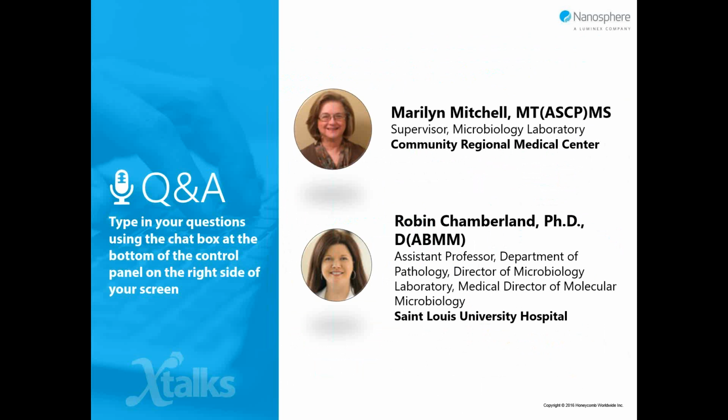We do offer this as a stat test. We don't have any other rapid influenza or RSV tests at this time. So we offer this stat for our emergency room and ICU or other areas of the hospital. So the time is a little over 2 hours. It's very easy to set up, and we're staffed pretty close to 24/7. Weekends at night, we don't always have somebody there to do the testing, but our coverage is really pretty good for getting those test results out.